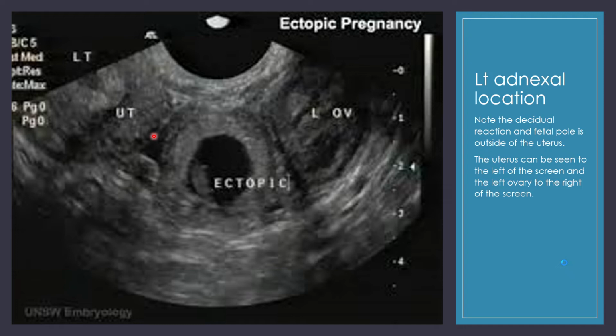So you may see what looks like a gestational sac, or you may just see something that's large. It's not an ovary, but it's not in the uterus. So those 3 things would be suspicious for ectopic, especially if they may be having a little tenderness on that same side that you see that mass on, okay?